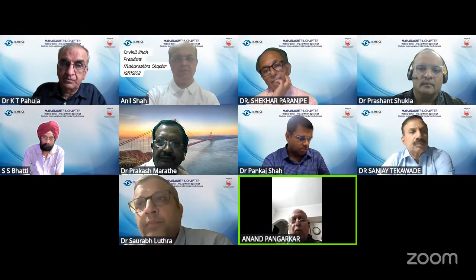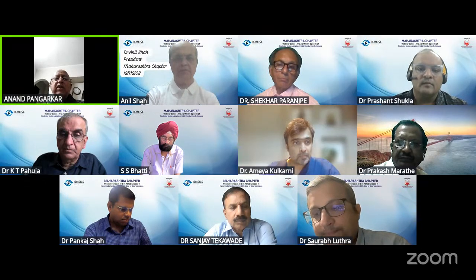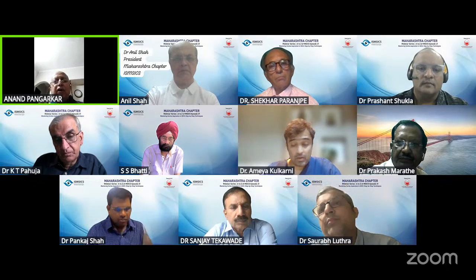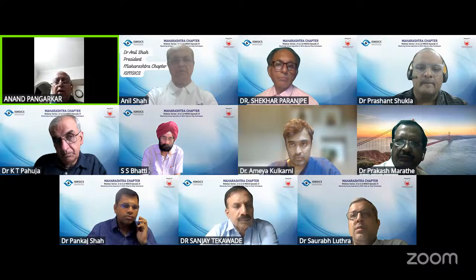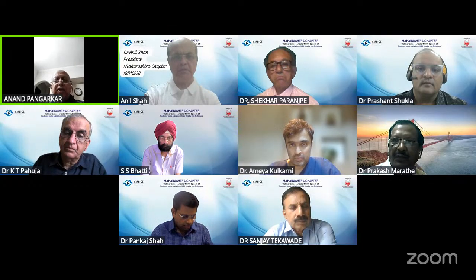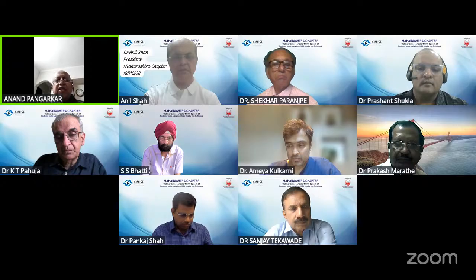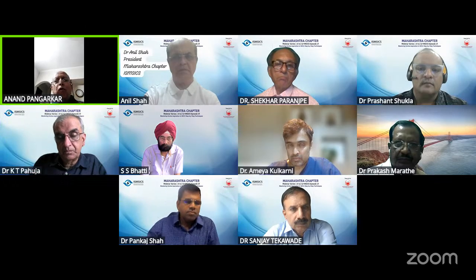However, there is one objection to the use of an AC maintainer from an inferior port, and that is it is an exposed port and likely to have more chances of infection. But otherwise, the AC maintainer is an excellent thing, and very little maneuvering is necessary even to remove the epinucleus. I compliment Anil Shah and the Aravind people for that spring-loaded syringe to help us in manual aspiration. All that we have to take care is that the aspiration has to be a little less than the infusion if you don't want to catch the posterior capsule.